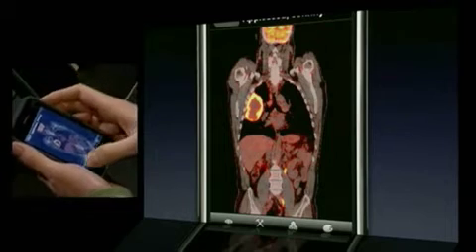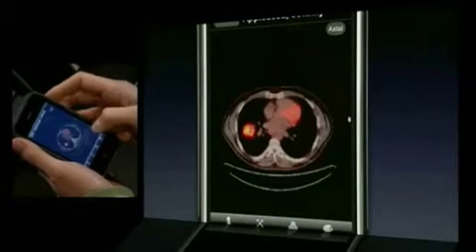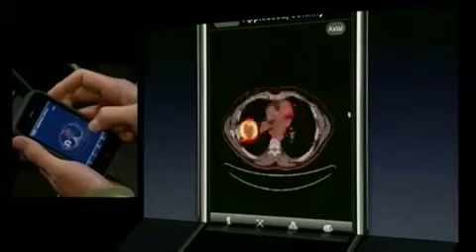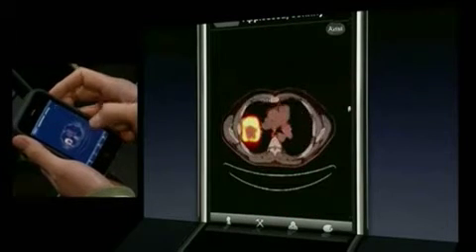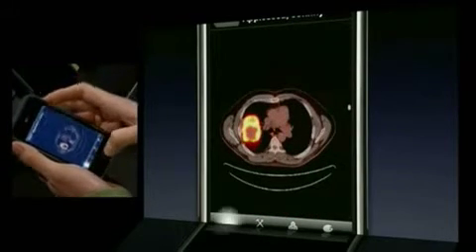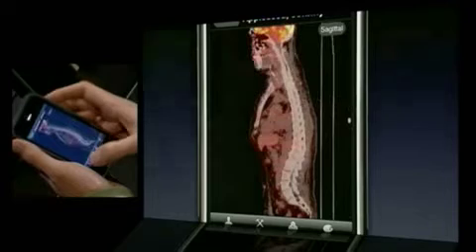Tap View to change the viewing plane so that you can see the data from the bottom, from the side, and from the front.